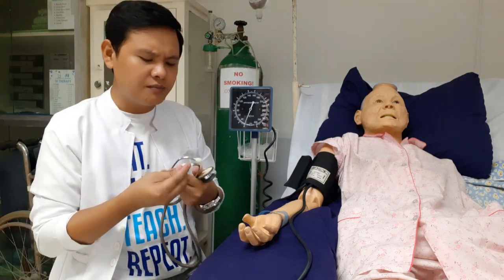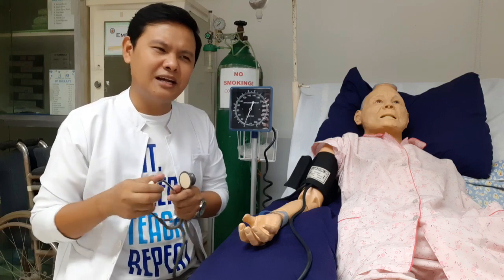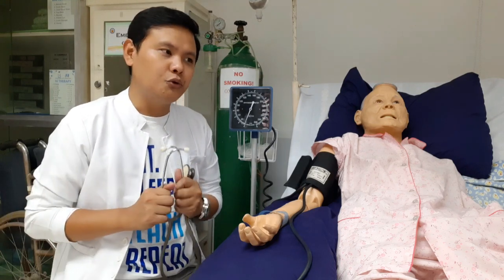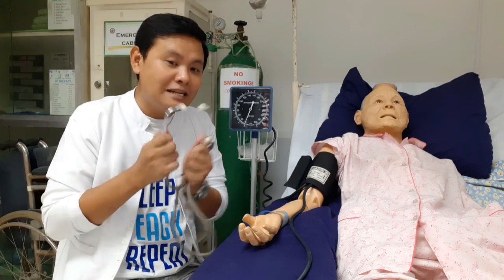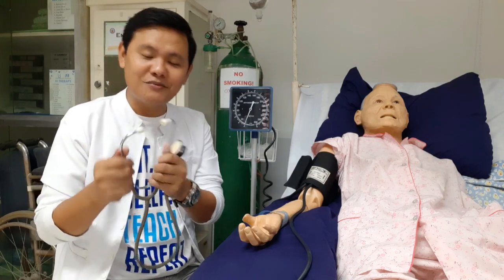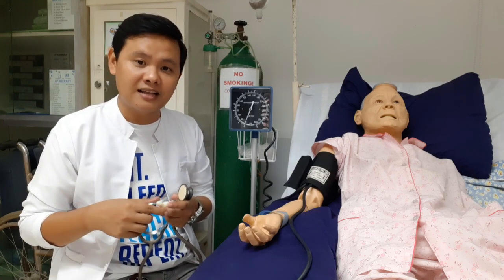But if it is your stethoscope, like me, if it is really my stethoscope, sometimes I no longer clean the earpiece, for the reason that nobody else makes contact with it except me. Now, if other people use this stethoscope, that is the perfect time that you should also clean the earpiece, because many people use it, many ears are entered by your stethoscope. So you have to clean it. If your hospital or institution uses a different disinfectant, why not?